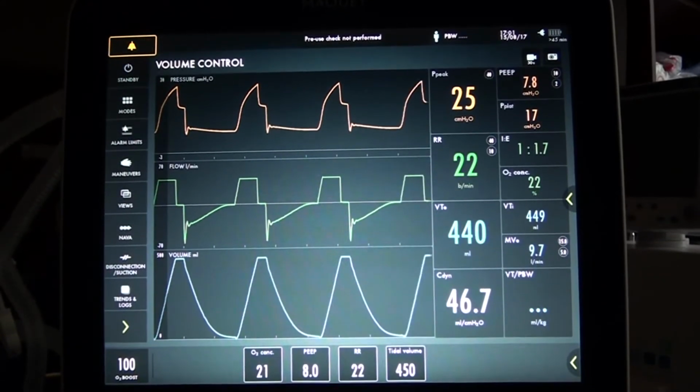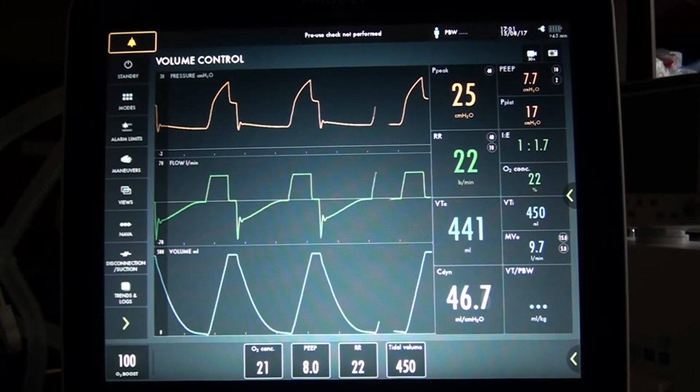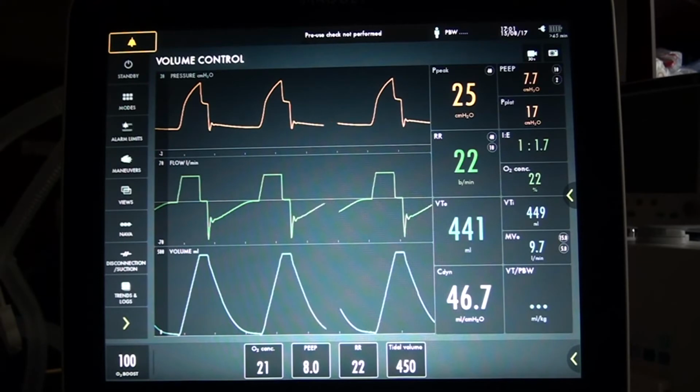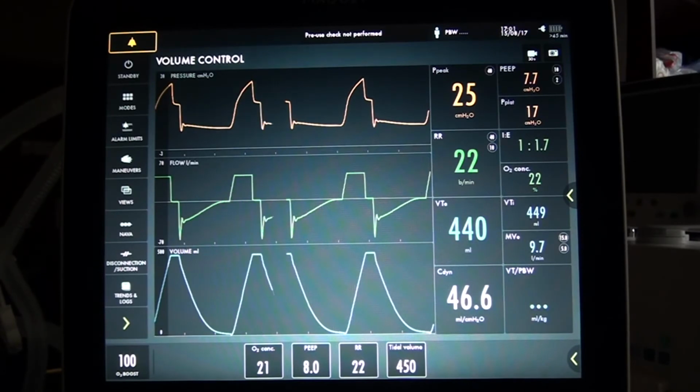One of the reasons why we made progress in this field is because we realized that mechanical ventilation is a tool which can be used to make pulmonary function tests in these severe patients and get information that would be impossible to get in a patient who is in respiratory distress. To understand that, let's have a look at a real tracing from a mechanical ventilator, what we can see on the screen of a ventilator. This is a tracing of a patient under volume control ventilation, and from top to bottom you see the airway pressure, the flow delivered by the ventilator, and then the expired flow from the patient, and the volume.